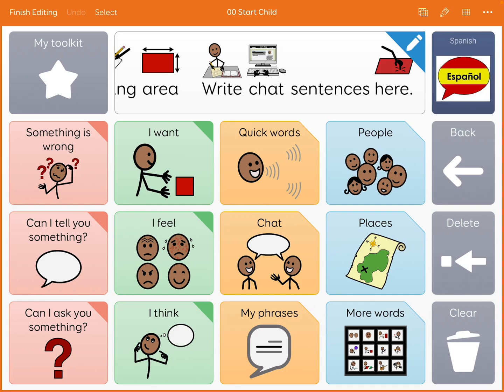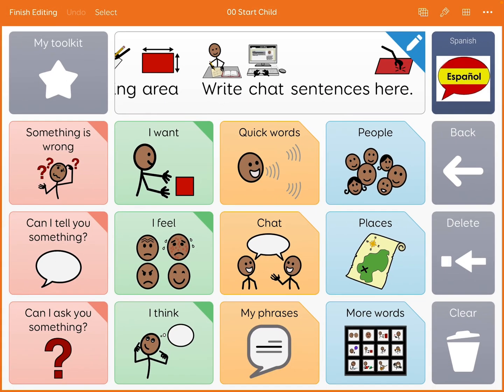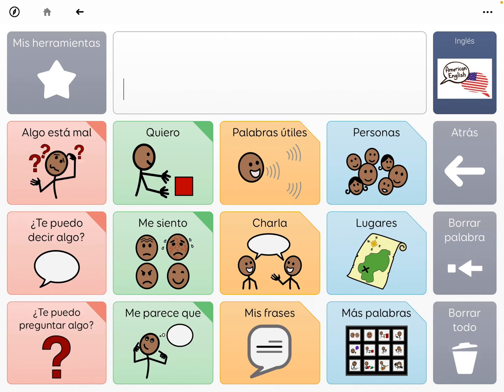So I'm taking that real estate of this button right here. I deleted the one that was there and added a button back using the command 'change grid set.' I labeled it Spanish and found an icon online that I liked that just said Español. Done. Finish editing. And boom — then I did the same thing for Inglés, being able to go back to English.